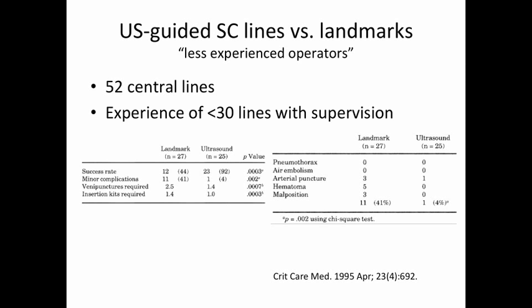So classically, I think what I was taught when I was first learning how to use ultrasound was that for the subclavian, it's just so easy that you probably don't need to use the ultrasound. So when you go back to the literature, though, there are 2 studies which I'll tell you about. So there was this study which was done in quote-unquote less experienced operators, so folks who had had less than 30 lines total experience. And they were supervised, of course, by folks who were qualified to supervise.